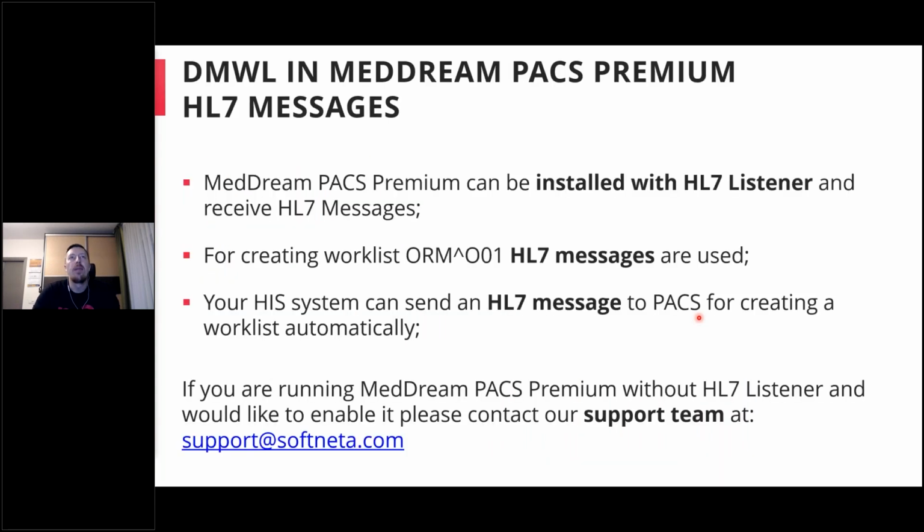And the third way a worklist can be created, the most complicated way I would say, is using HL7 messages.